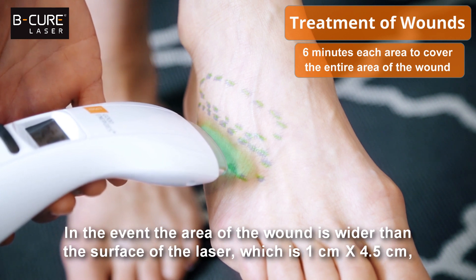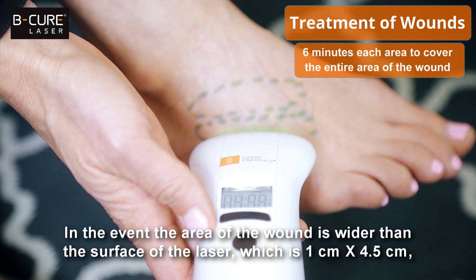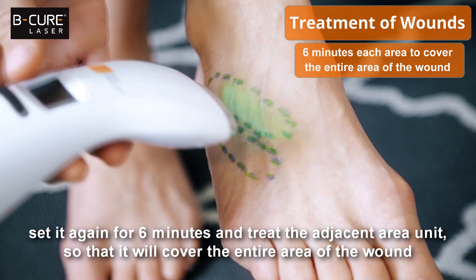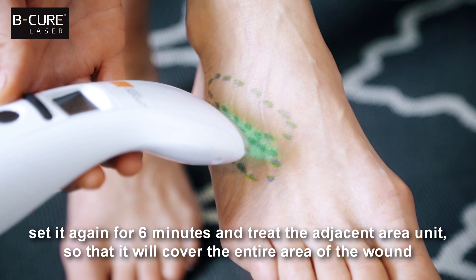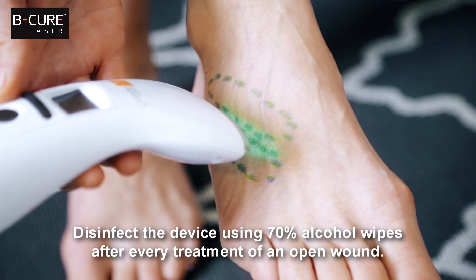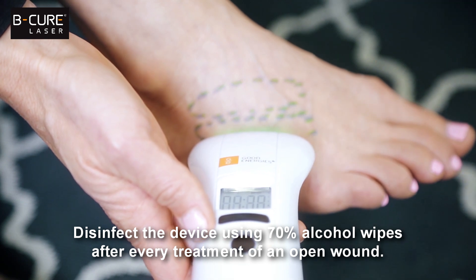In the event that the area of the wound is wider than the surface of the laser, which is one centimeter by four and a half centimeters, set it again for 6 minutes and treat the adjacent area so that it will cover the entire area of the wound as well as its margins. Disinfect the device using 70% alcohol wipes after every treatment of an open wound.